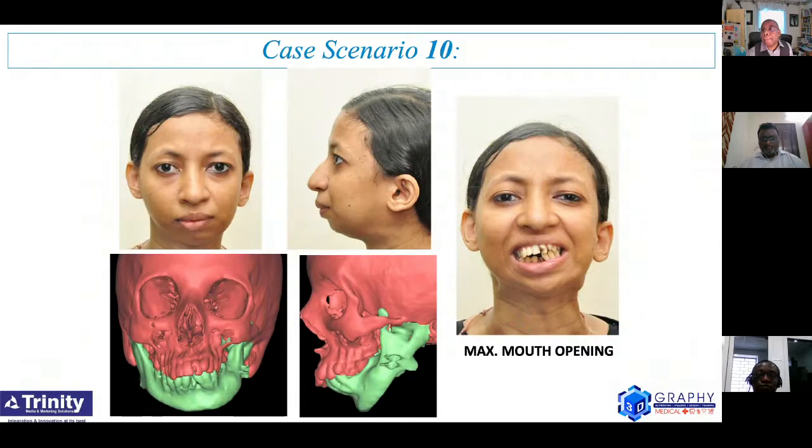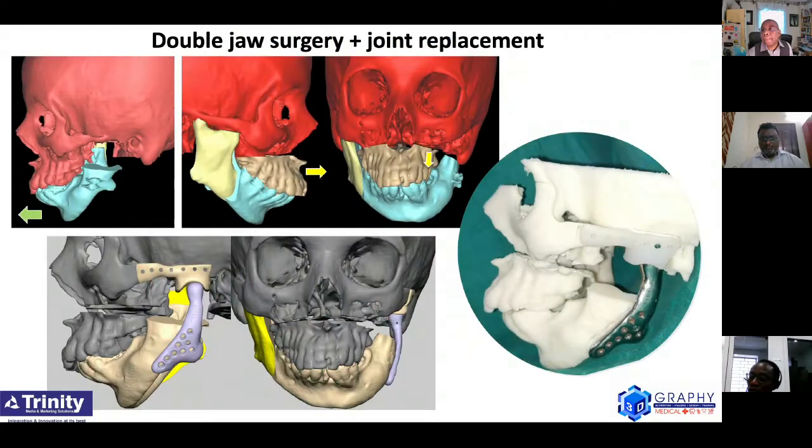This is another patient who came to us with similar complaints. We fabricated a plan with CTARs from Chennai. We designed these indigenous models with the help of John. I think I've been eating John's head for the past, I and Dr. Mustafa, I should not forget, my colleague, whom we worked together as a team, along with the biomedical engineers, as well as John himself, where we planned the movements for the lower jaw. When I say plan the movements, remember in my speech, initially I spoke about 3 terminologies. That's the roll, yaw, and pitch, where how much of the lower jaw has to go down.